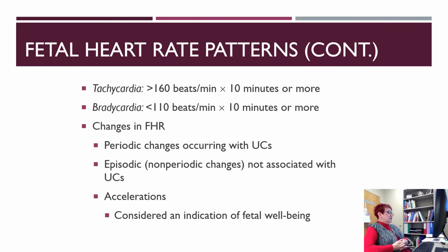Okay. So tachycardia is above 160, and that often indicates a maternal infection. Remember that. Tachycardia in the fetus, greater than 160, sustained, as you see here, for 10 minutes or more, is often indicative of maternal infection, and that's not uncommon with premature rupture of membranes. In other words, her water broke 2 weeks ago and nothing's happened. That automatically means there's an opening there, so we want to keep track of that. Bradycardia, less than 110 for 10 minutes or more, and for a baby to go that low and stay that low, it makes everybody nuts, and people are moving, getting things done.